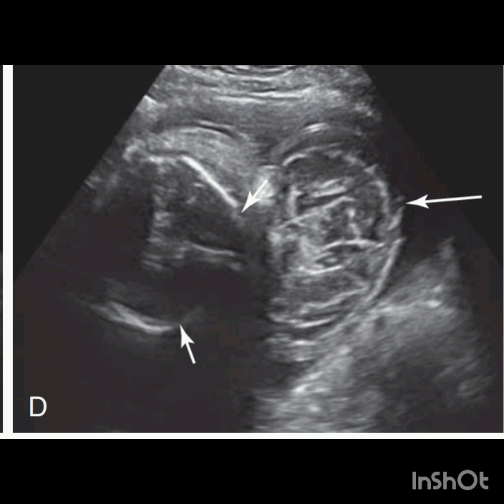This is the image of the head of the same fetus at 31 weeks gestation. You can see a large amount of herniated brain tissue indicated by the long arrow and a large calvarial defect indicated by the two short arrows.